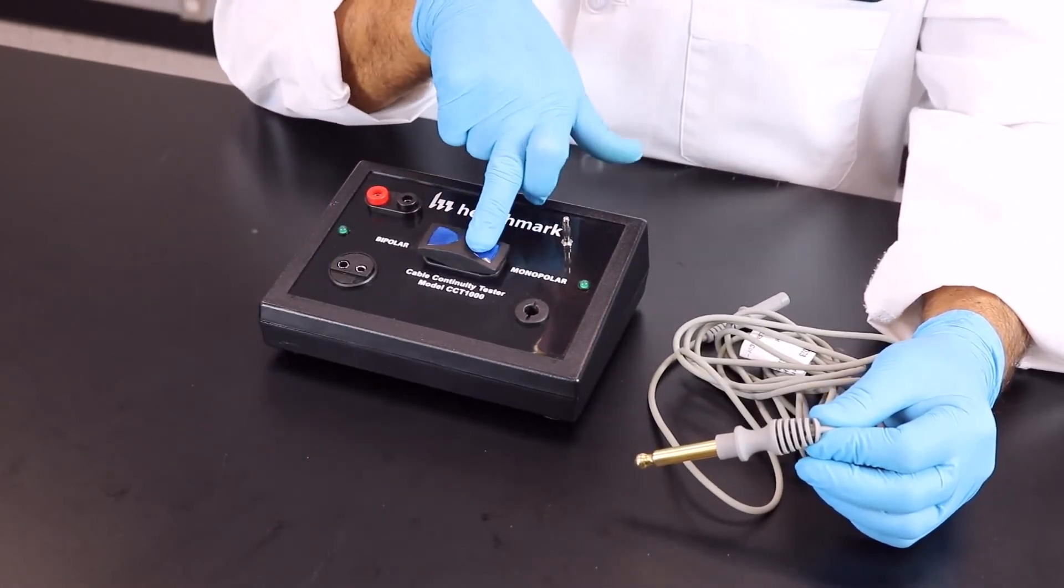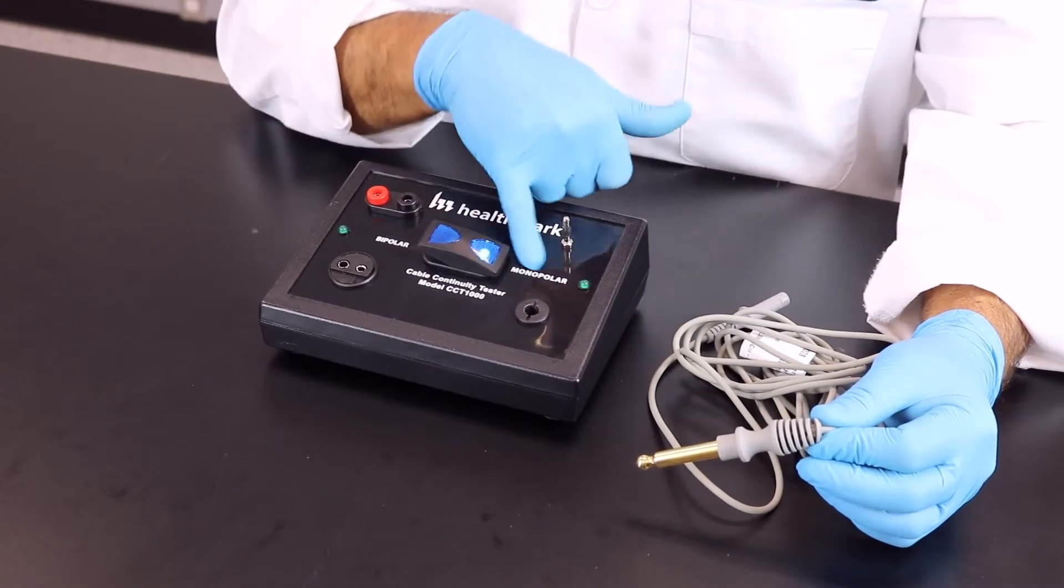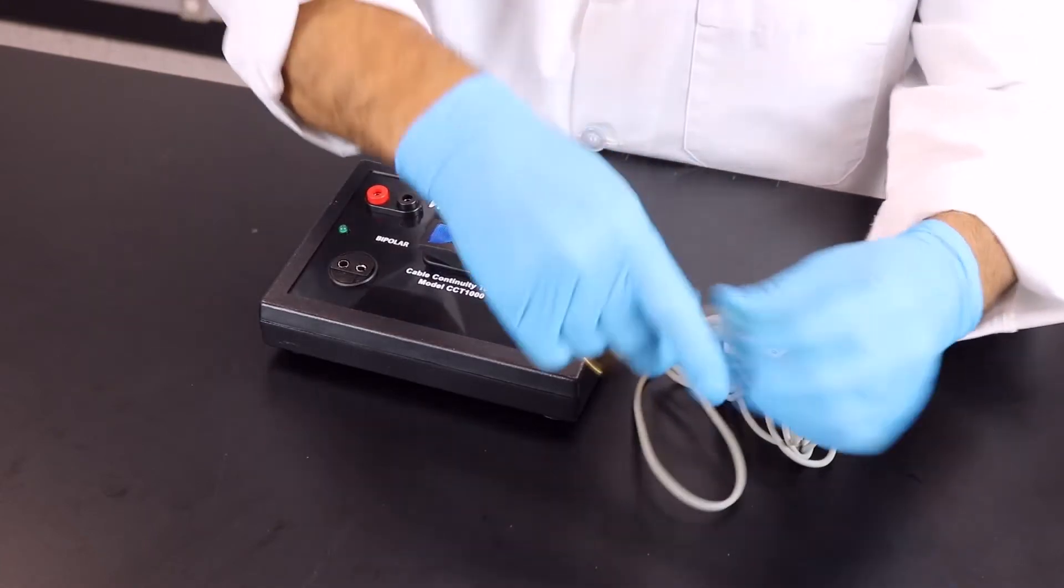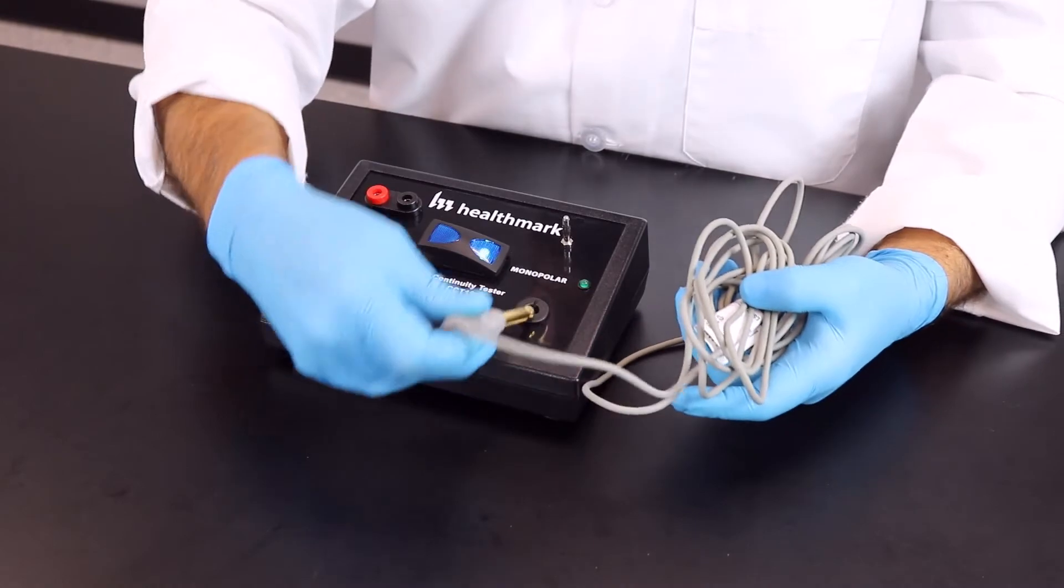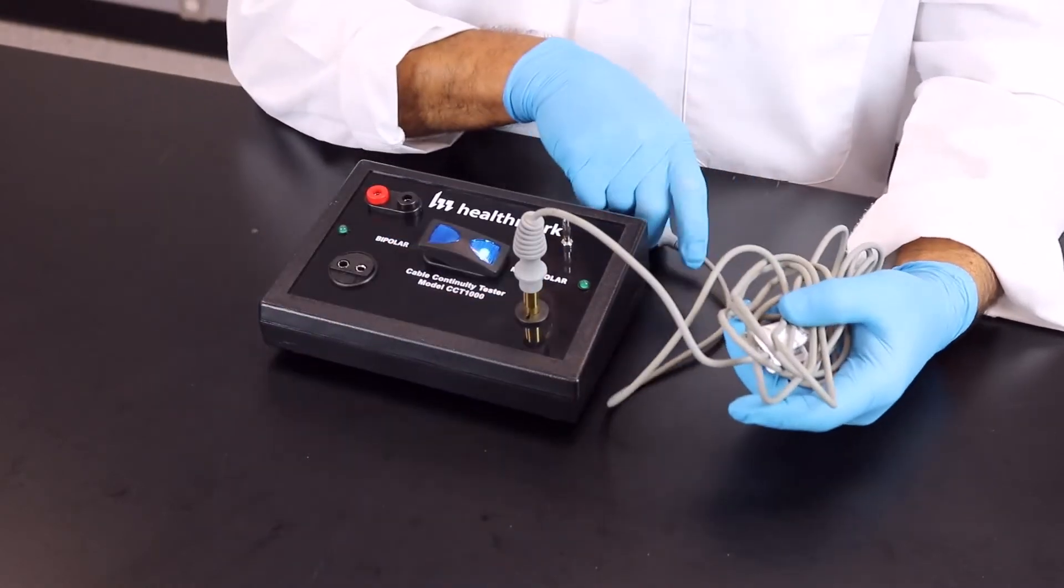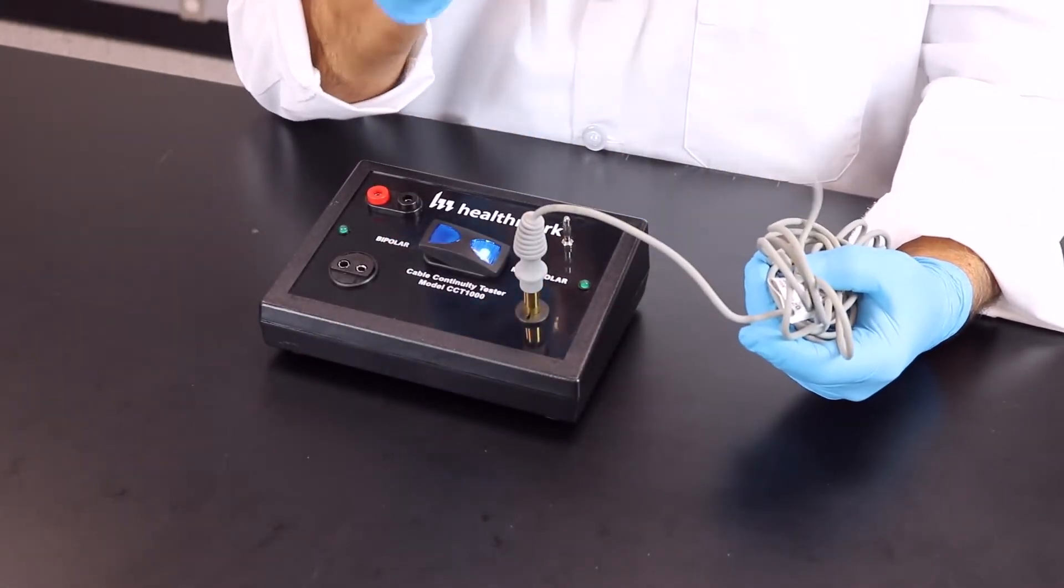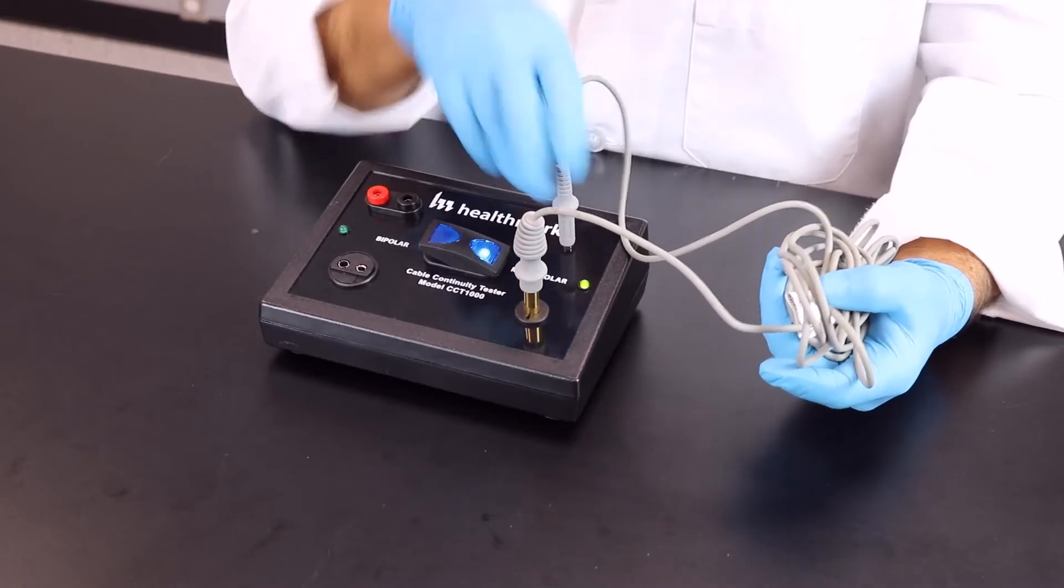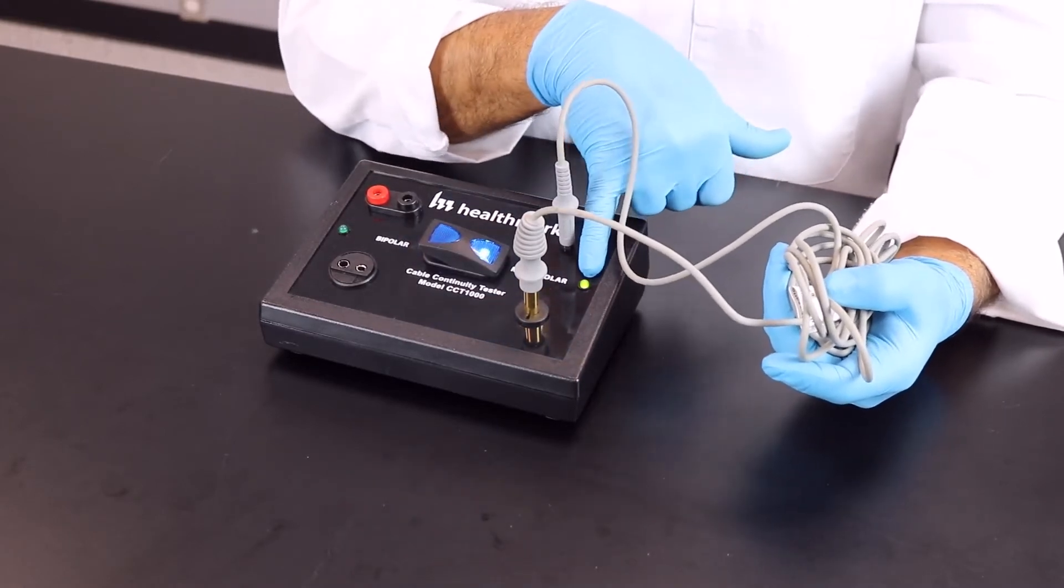You're going to take your toggle switch and turn it on towards the word monopolar. You're going to take the proximal end of the cable, put it into the port at the bottom, your distal end of the cable into the post on top. Automatically, you're going to see the light go on.